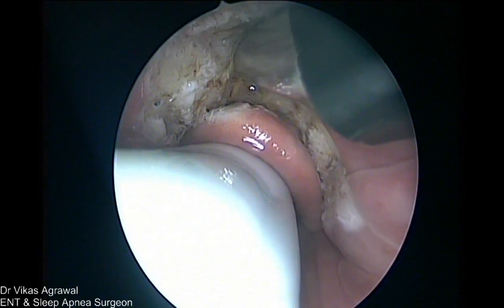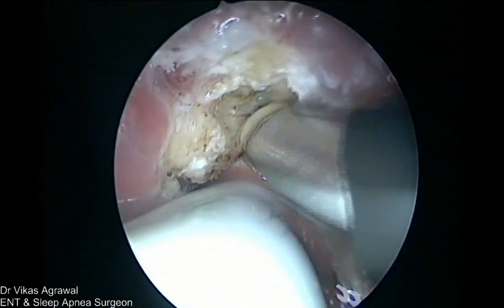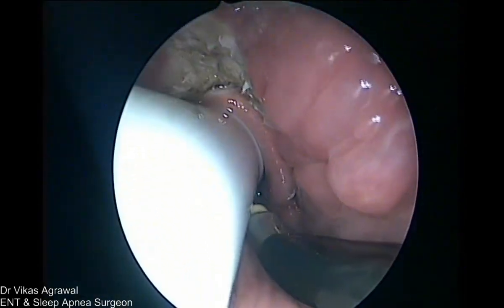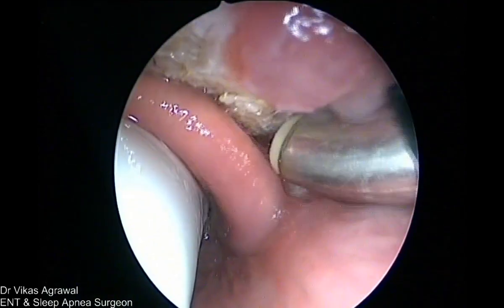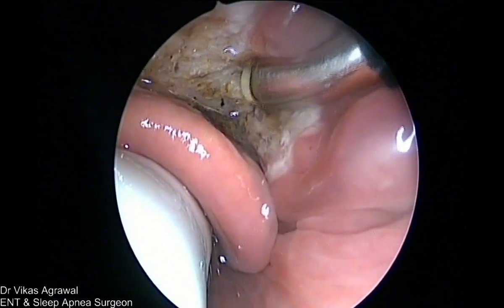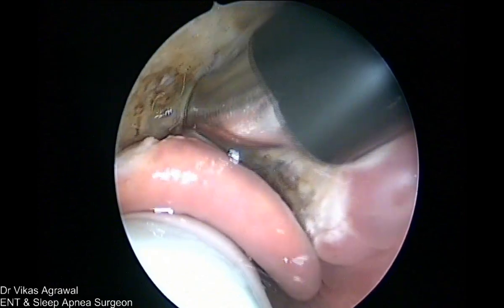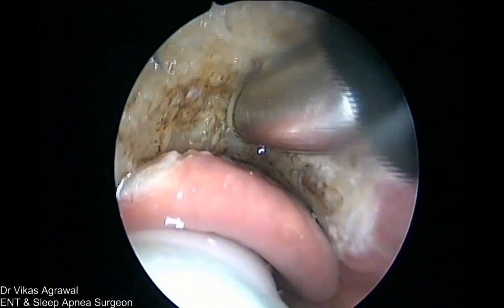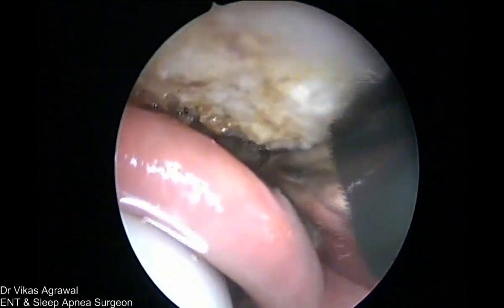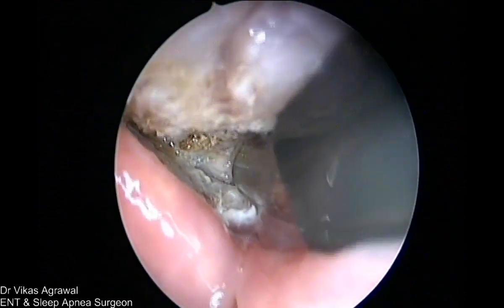If we do MMA, that will give him a better result. But this surgery, as you see, is over in less than 1.5 hours. Though I can remove more, I have already reached the muscles in the midline. I have removed the muscles also a little bit. Laterally, there is no real great need to remove a lot of tissue, because that will add to my complication rate.